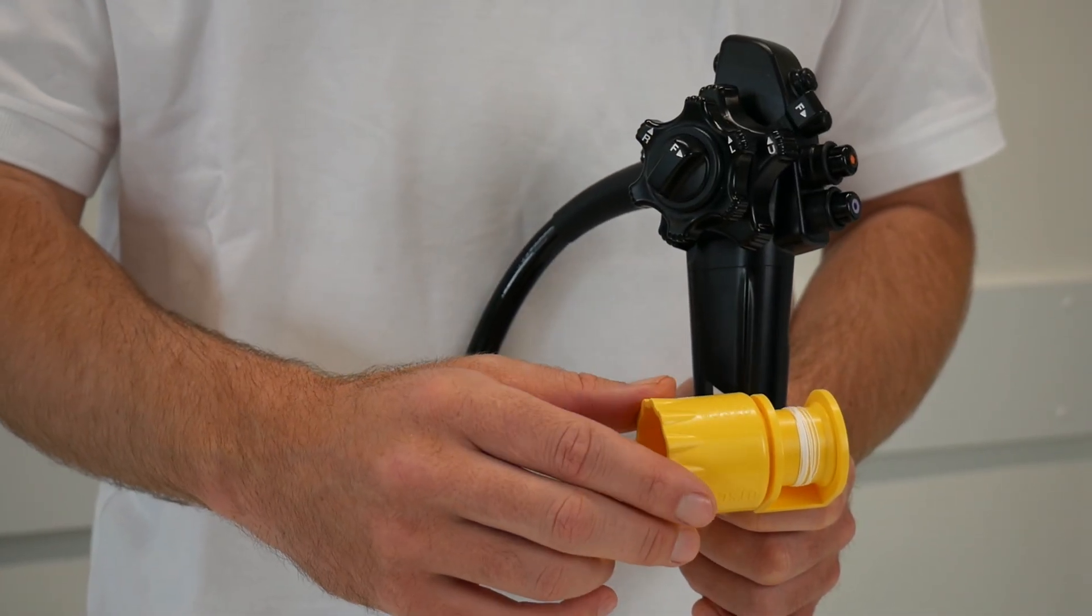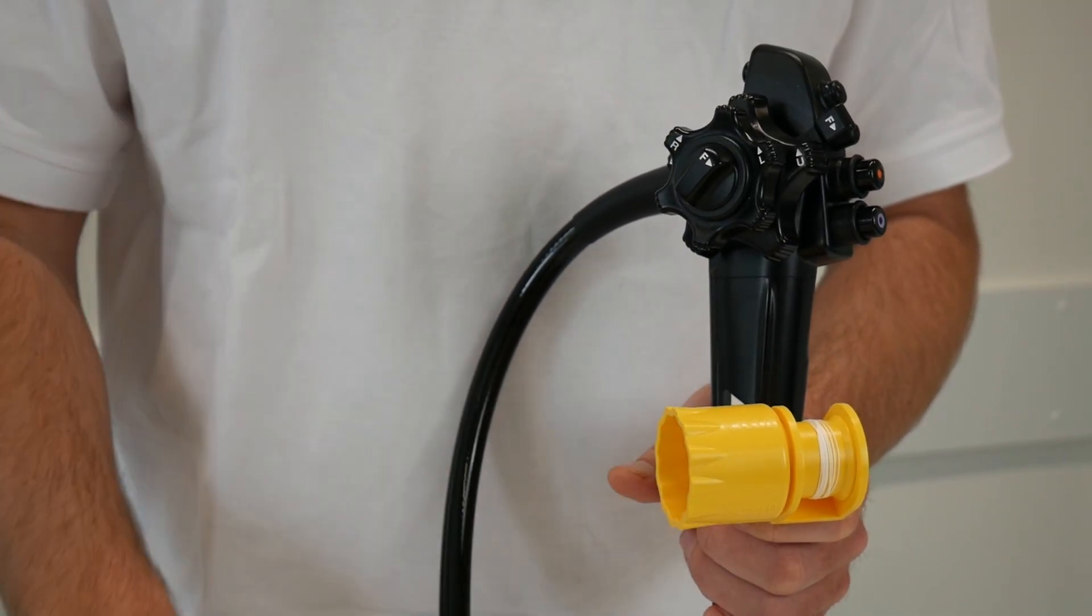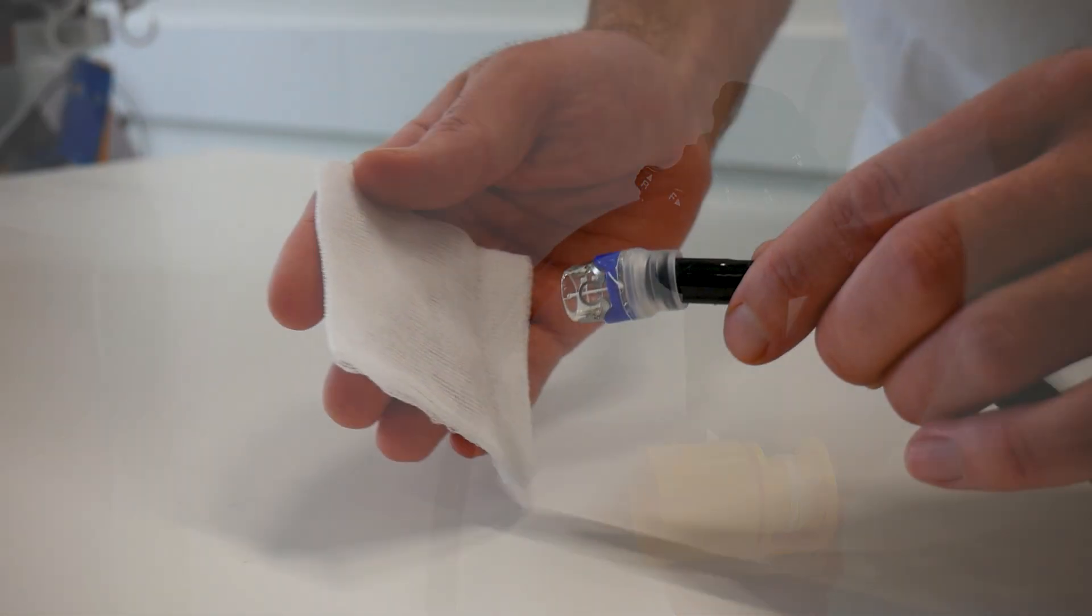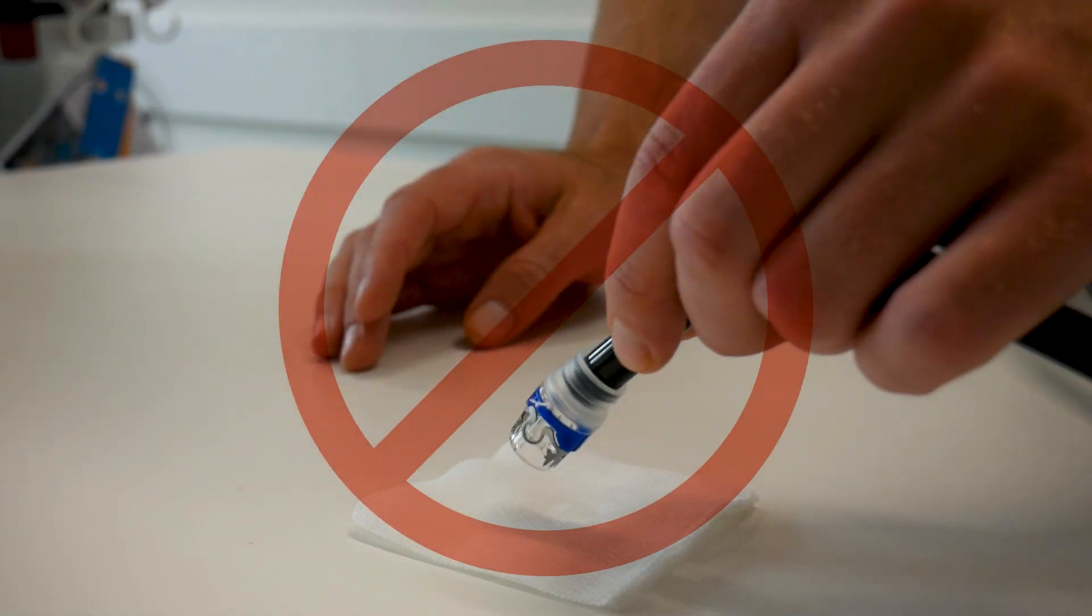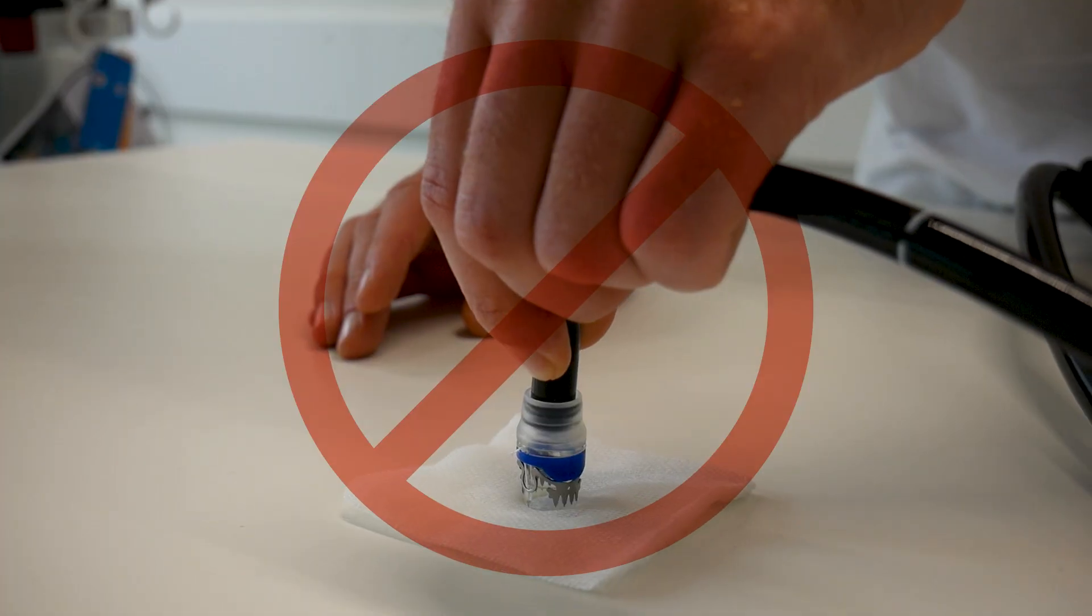Continue winding the release thread onto the hand wheel until slight tension is felt. Do not press the cap against your hand or a table during assembly to avoid damaging the endoscope tip or injuring your hand.